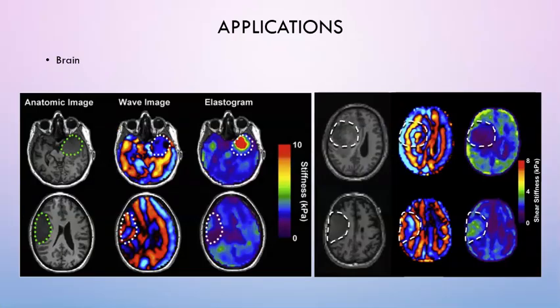And then one of the uses of elastography, with MRI, not ultrasound, we can look at the brain and see lesions within the brain under MRI. So even though it's surrounded by hard bony structure, using an MRI, you can still identify tissues that are hard and thus malignant using elastography.